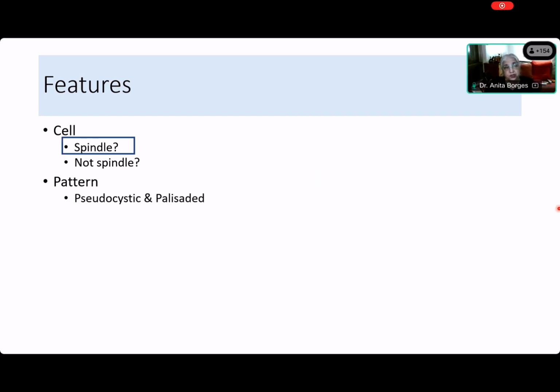Yeah, it is pseudocystic and palisaded. So now what next? So you've seen the spindle cells, you've seen that they are pseudocystic and palisaded. Now we have to come to some interpretation. Interpretation means what? We have to think of possibilities. So what are the possibilities?